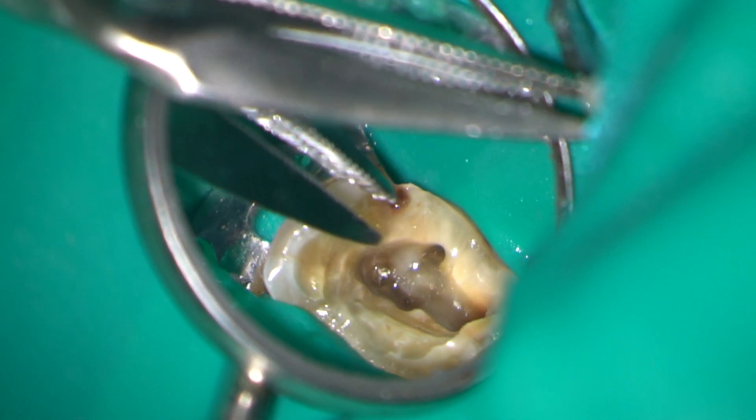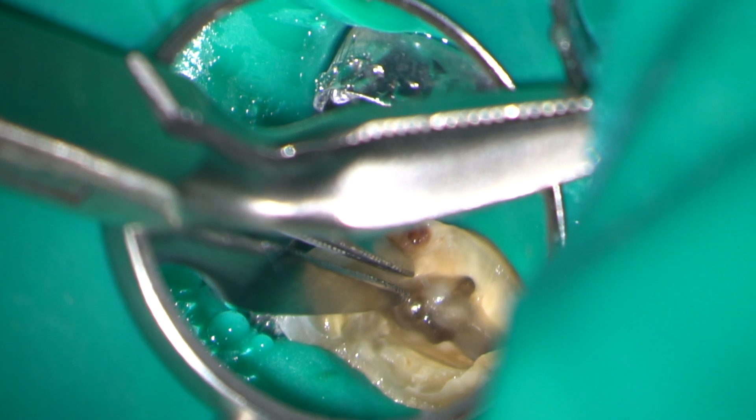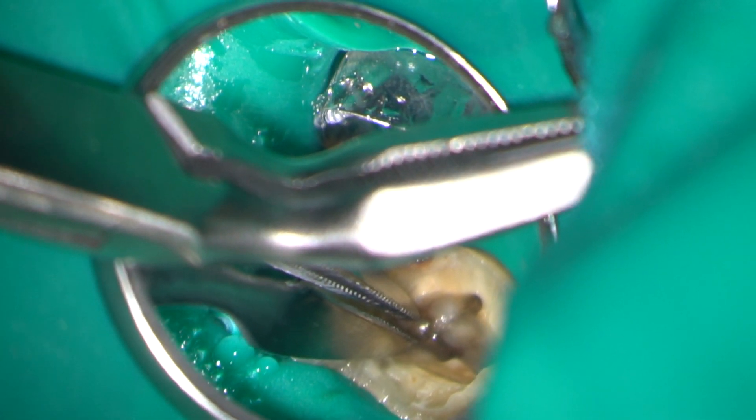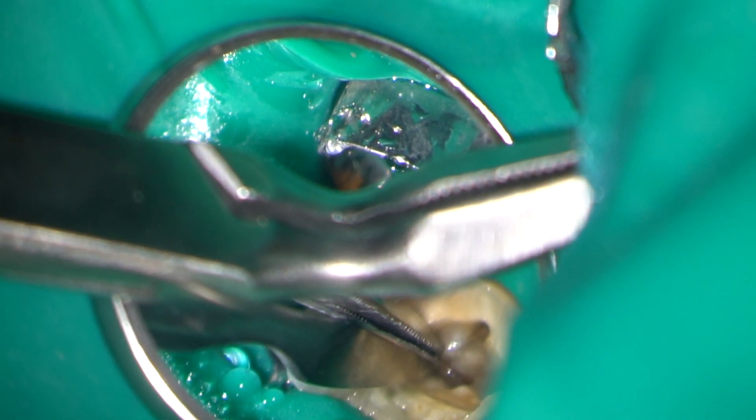I can now grasp the head of the silver point and retrieve it using Steiglitz forceps. By preparing and irrigating the MB2 first, I have helped loosen the silver point and made retrieval easier.